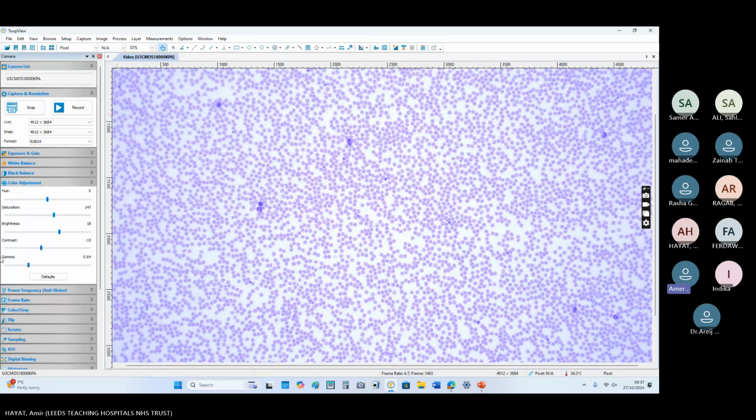This is the power 10 blood film, and we will go to power 50, but I need a volunteer from the lab side if they want to come in for the blood film. Is there any volunteer there? I'll give it a try.